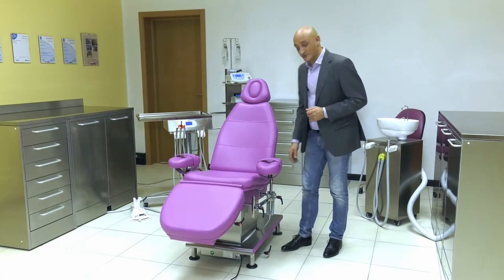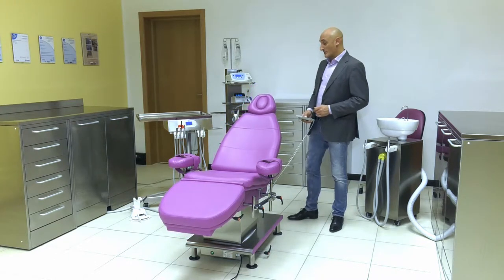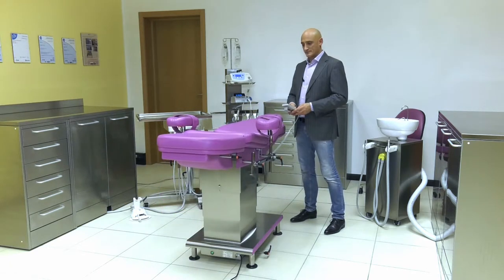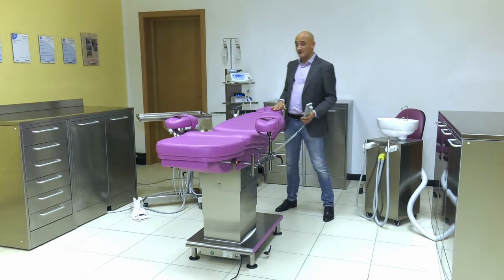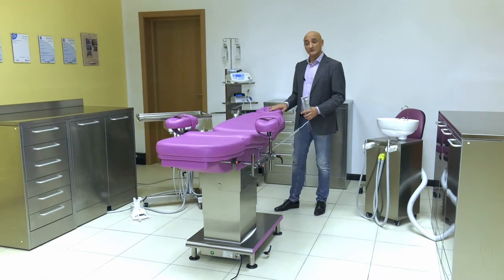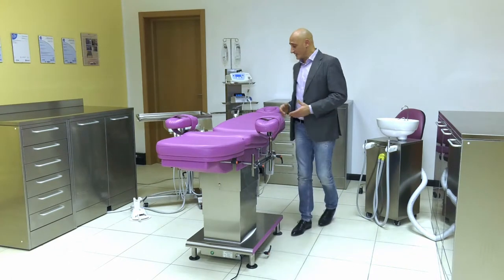Now let me show you a very important detail in this chair. We can see how, if I put the chair into the bed position and pull up the entire chair, the patient's head is positioned 1 metre from the floor. This is different from a standard chair, which is a maximum of 80 to 82 cm. This allows us to work also standing up.